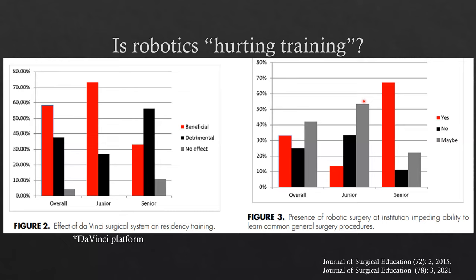the robotics for spine surgery are basically like a navigational robot. It's almost like the ROSA robot for stereotactic EEG. Essentially it's the exact same concept except for the spine. It basically brings you to a fixed trajectory where you can use a set of electric drills to place instrumentation. But it is not really much more than that.